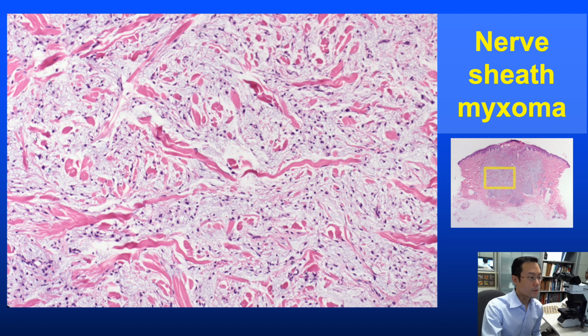Actually, the central portion of this tumor exhibits the more characteristically prominent myxoid stroma, and some people have considered the possibility that the nerve sheath myxoma is kind of an endoneurioma, if you will, a proliferation of perhaps a modified Schwann cell in conjunction with endoneurial connective tissue.